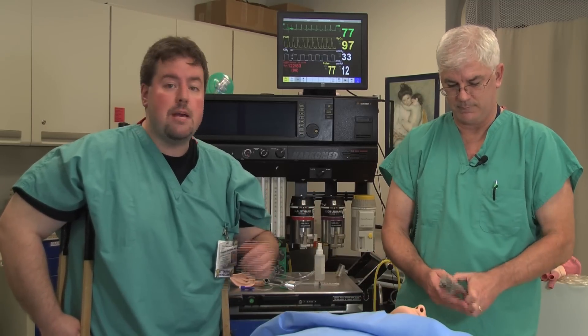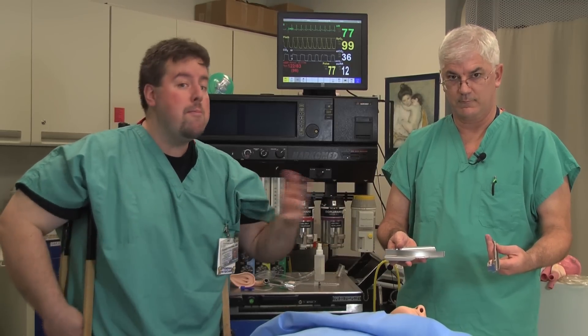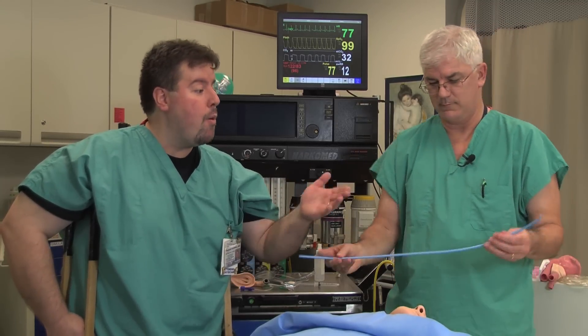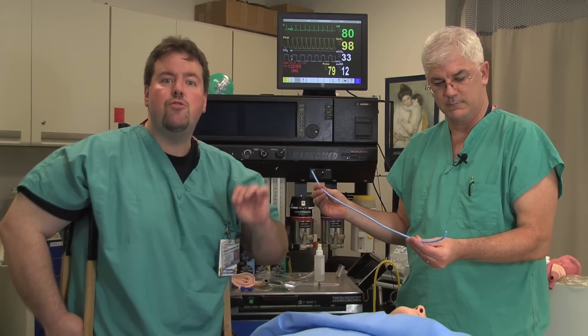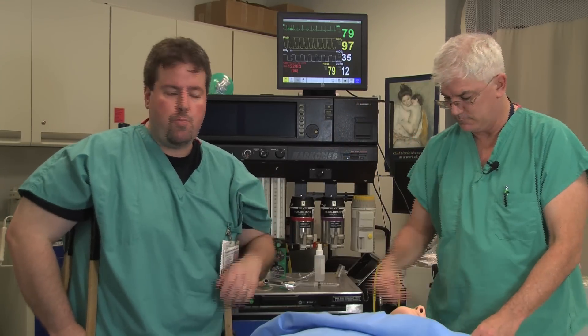We're going to want some type of laryngoscope. We want to have an array of blades — different people's faces, different people's shapes may need different types of blades, the straight, the curved, things like that. We may need the bougie. The bougie is used to introduce a tube, sometimes without direct visualization, or in a way that requires something that we may not be able to reach with the tube itself.